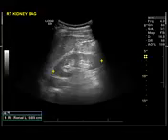This is because there are many types of tissue in the sinus, including fat. So there's a collecting system, there's fibrous elements, there's the vasculature of the kidney. So this is the region of the renal sinus. It should be nice and compact. This is the renal parenchyma, and in this patient, we do not appreciate a difference between the cortex and the medullary regions. But the kidney is normal, it's about 10 centimeters in size.